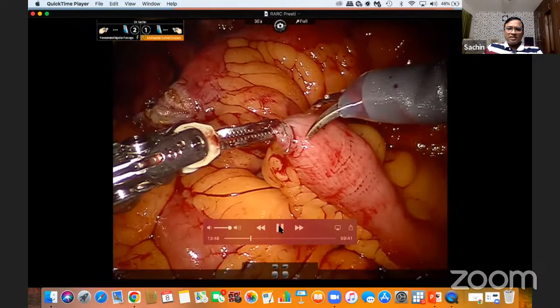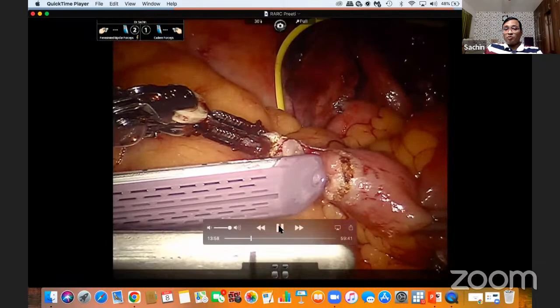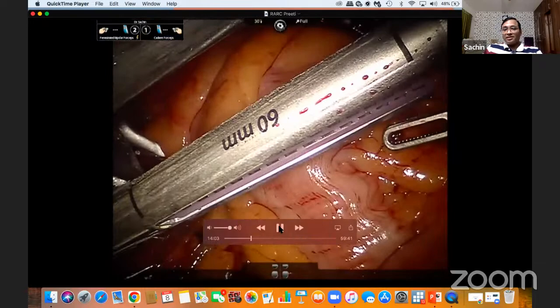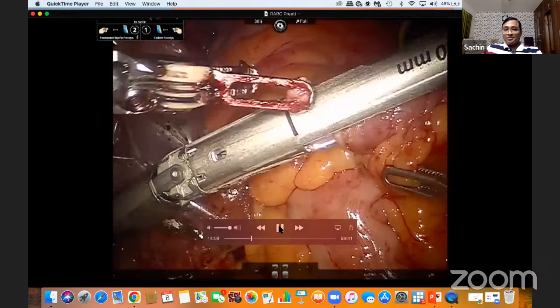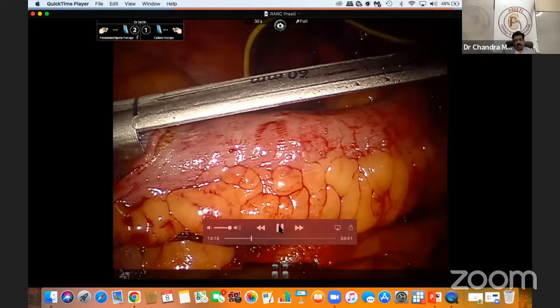The assistant is very crucial in this procedure. Different types of staplers are available. I personally would prefer a motorized stapler, but it's expensive. What we are using is this Endo GIA Tri-Staple technology by Covidien, but you require a good assistant. Here, entering these two and making them parallel is really difficult unless the assistant is good and stay stitches are taken. And the stapler also should come in the proper direction.